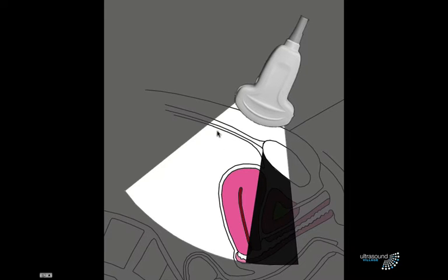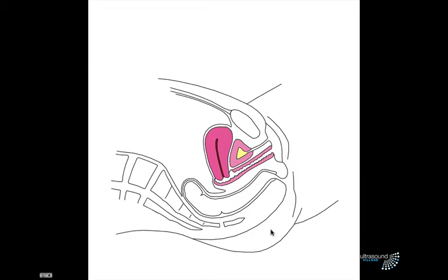We also know that behind air, which is the other enemy of the ultrasound, and there's air in this bowel gas here, you won't see anything. So, with the probe like that, this is the image you get. You can see the anterior abdominal wall nicely, the symphysis pubis, but behind it, you really can't see anything at all. How do we fix that?